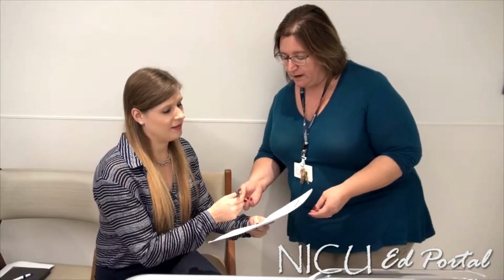Yeah, no, that makes sense. No question. The scan itself is done exactly the same way. The baby's wrapped the same way. All the same protocol that we would use for any scan happens. And I go with them and sit and monitor them. So if you're willing to go through with that, I'm going to give you the consent form. I'll review it with you, and I'll let you know when the actual scan's going to happen. Okay? You sign and then I sign.